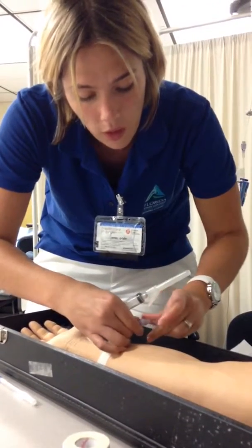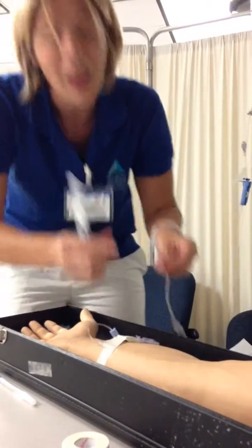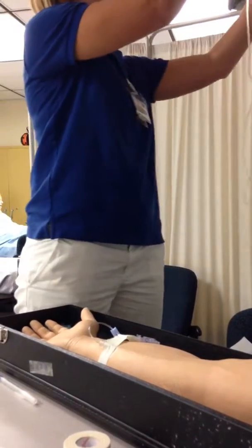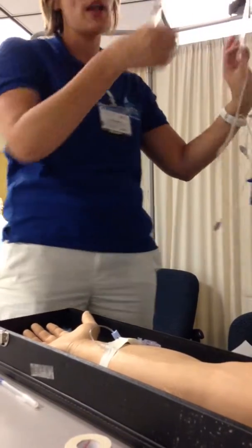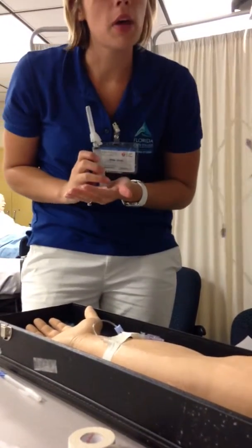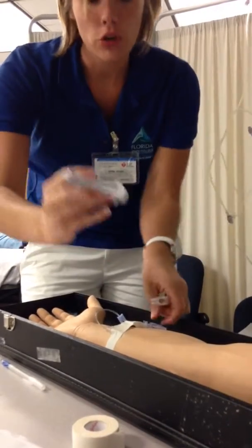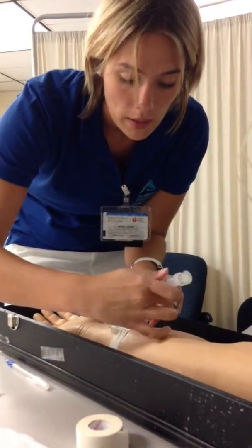It's 60 minutes later, the bag's empty, and you disconnected. I'm going to put an alligator clamp on here so this tubing can be used again. At this point, I am back in my patient's room. I still have 3 mLs from the 6 ml that I drew up. I've been back periodically to check on him. I'm going to clean my hub again.